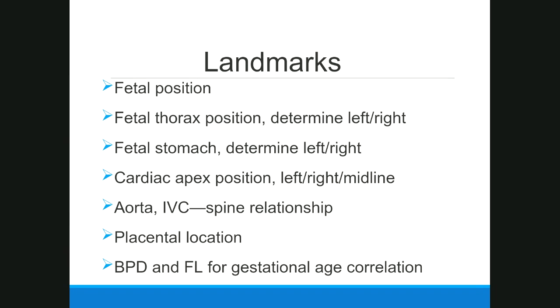You're going to be fighting a losing battle trying to determine if the heart's on the right side of the chest, or if everything is where it should be, if you don't understand the fetal lie and presentation. So that's first and foremost. Once you do that, then you can start evaluating the thoracic cavity and determine if the heart is in the proper place in the thoracic cavity.